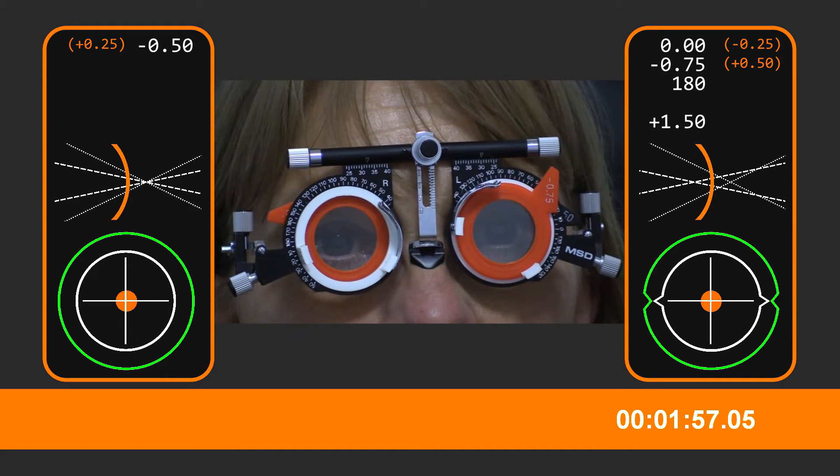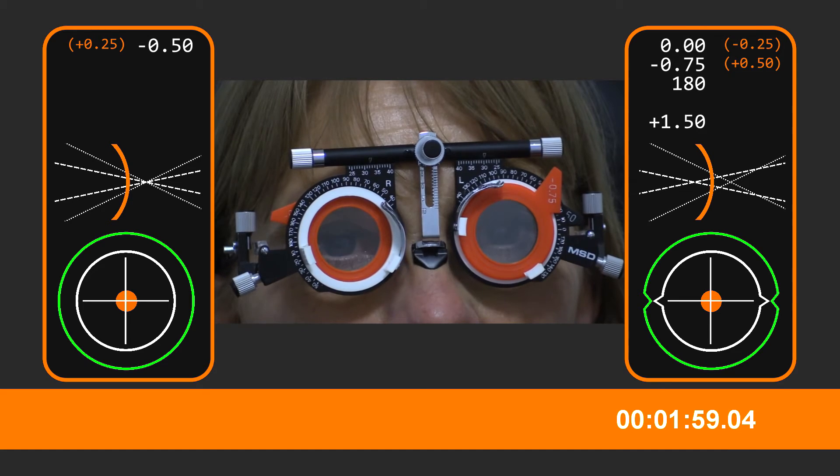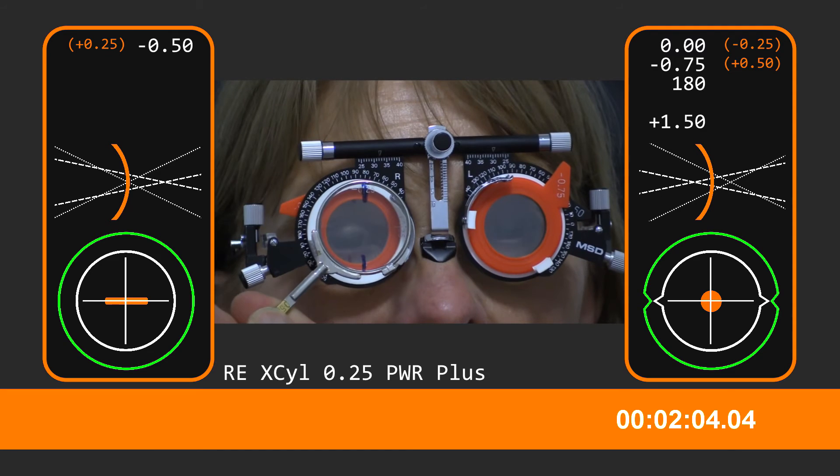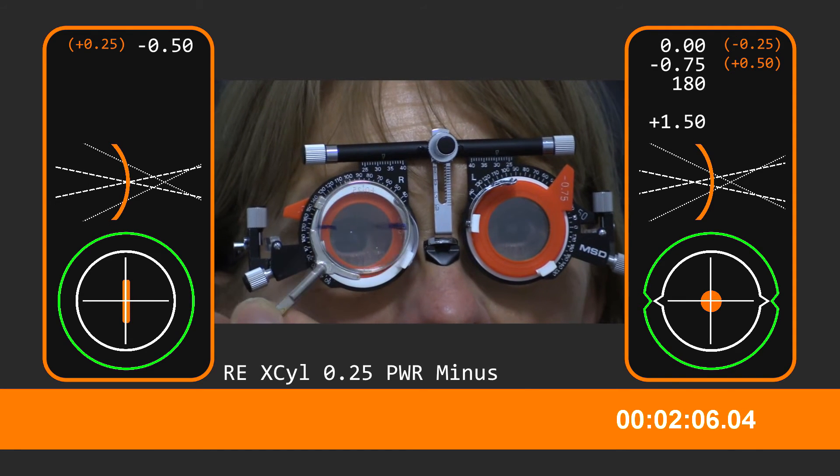And then have a look at the spots here. Now, which side of this lens is clearer? The first side, the second side? That's it. Okay. And again, first one or second side? Best one.